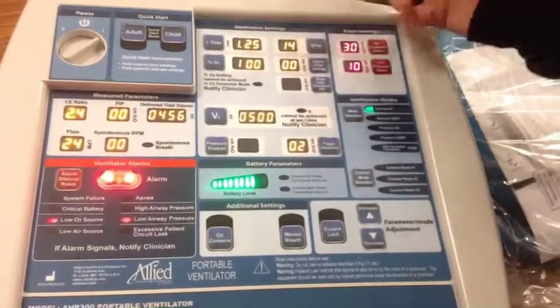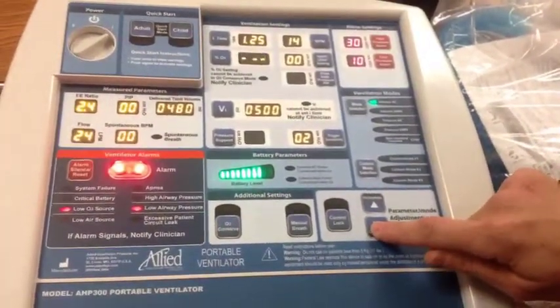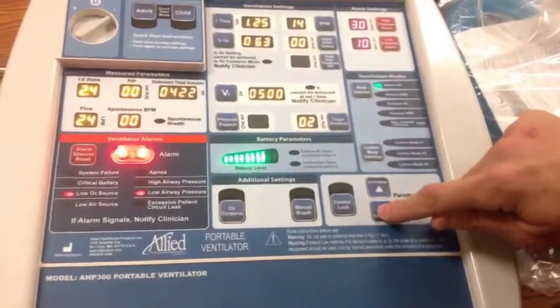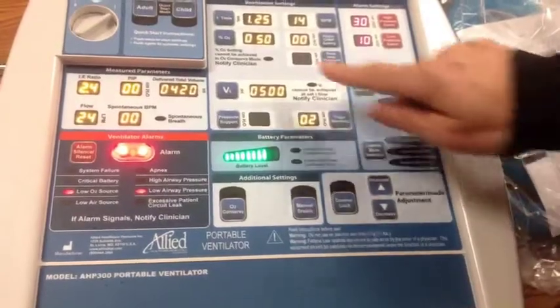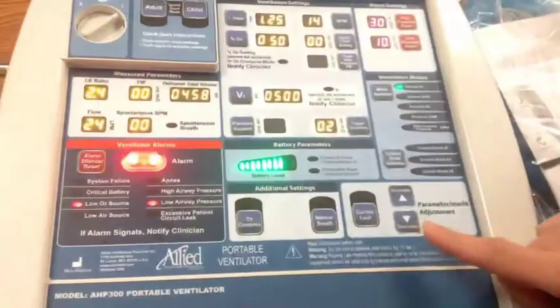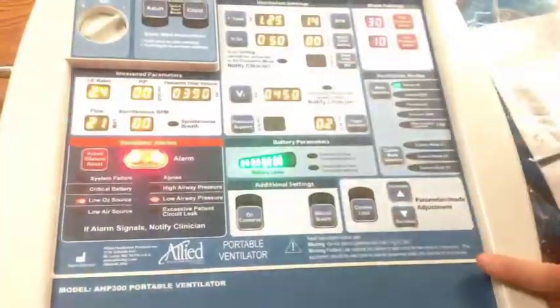Let's say, for instance, your patient is AC of 14 with O2 of 50%. So I just clicked on the O2, and I'm going to push the decrease button until I get down to 50. And then since I've made that change and it's still blinking, I must push the button again to activate that setting. Tidal volume is here. You click on that, and then you can adjust your tidal volume to wherever you need it to be. I'll leave it at 450 for now.